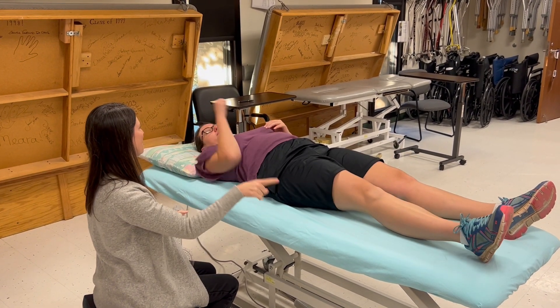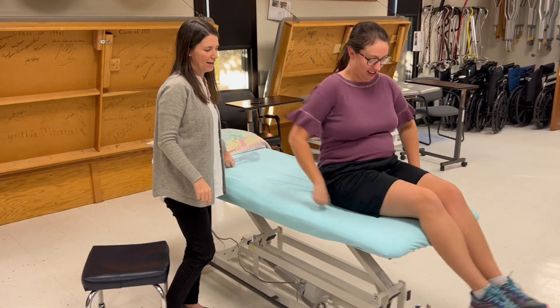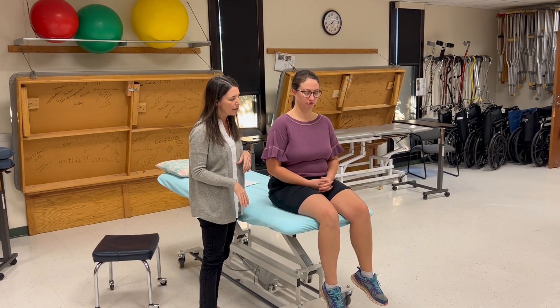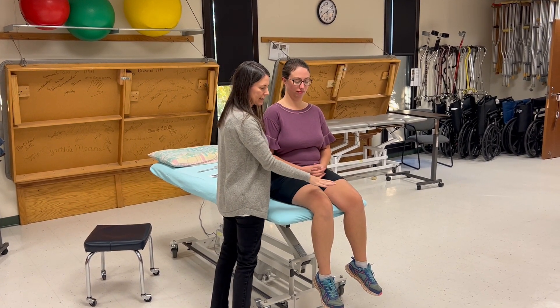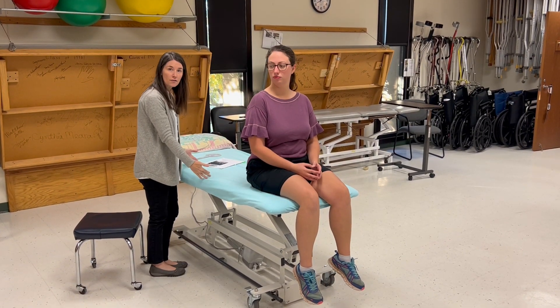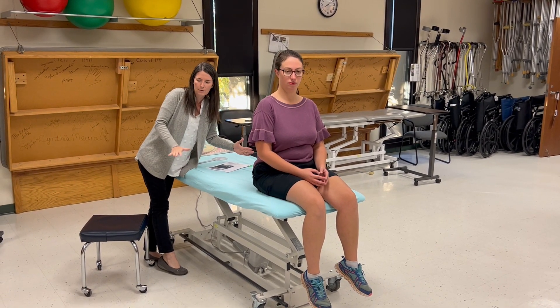For MMT, have the patient sit on the short edge of the table. I highly recommend using the short edge for hip flexion MMT because from there I can use my stabilization hand and resistance hand while maintaining good body mechanics. If she were in the center of the long edge, I'd have to lean over to stabilize and provide resistance, introducing unwanted twisting and bending into my back.